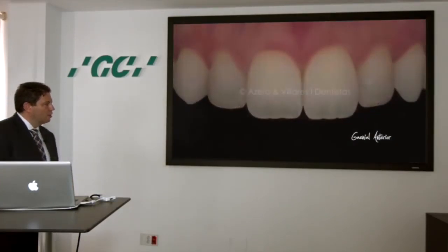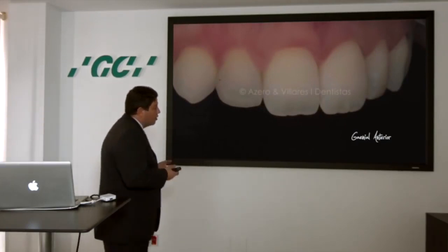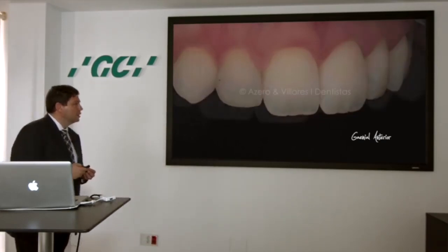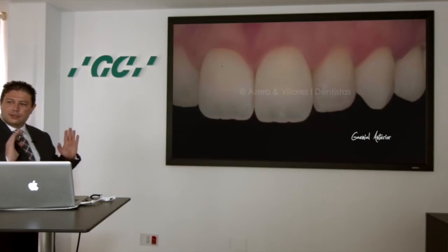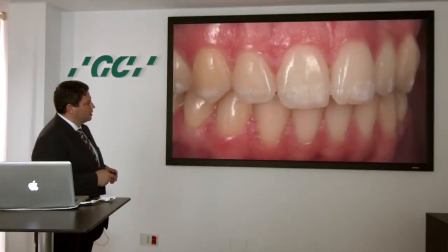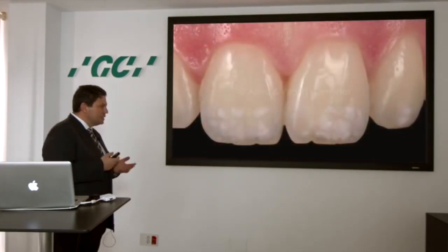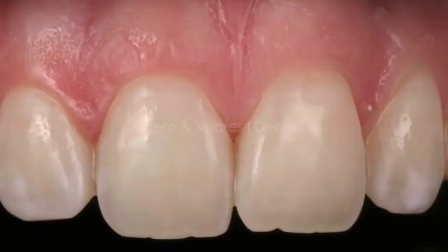Then we check the color with a polarized filter that gives us the real color of the restoration and of the teeth. And we have very natural results without touching the enamel. The patient stays exactly the same as he was at first, and then she's very happy. Very small tips in aesthetic dentistry, very easy cases, but we need to know the material we're using, because if we try to eliminate this without the restoration being seen by the patient, it's so important.